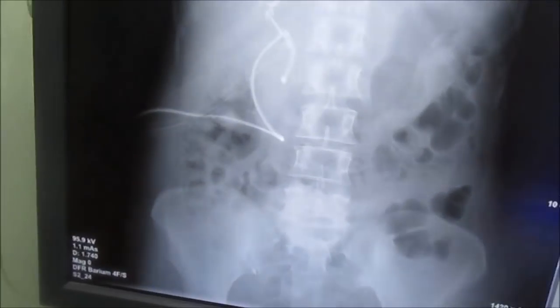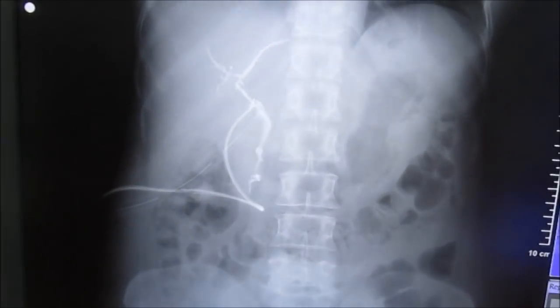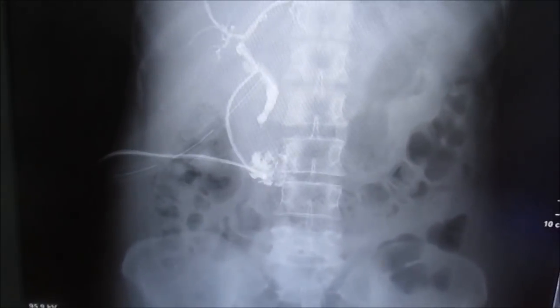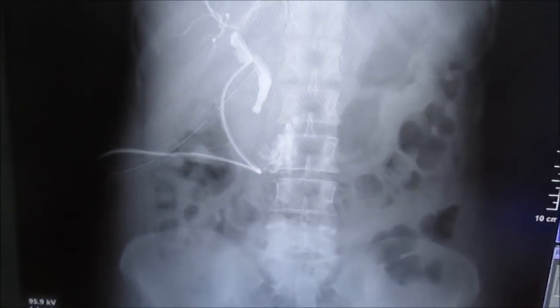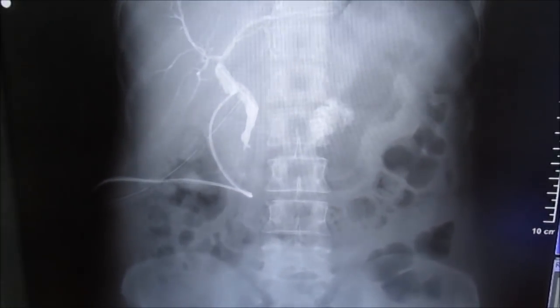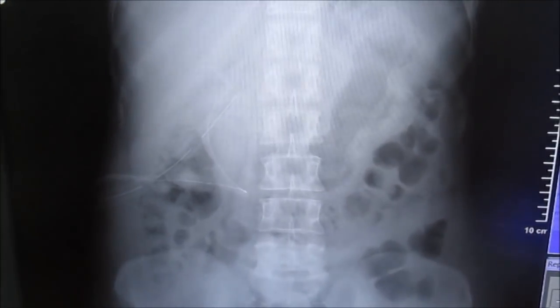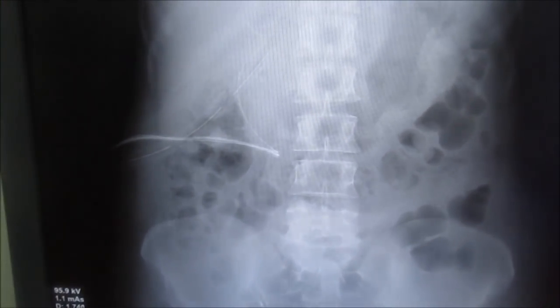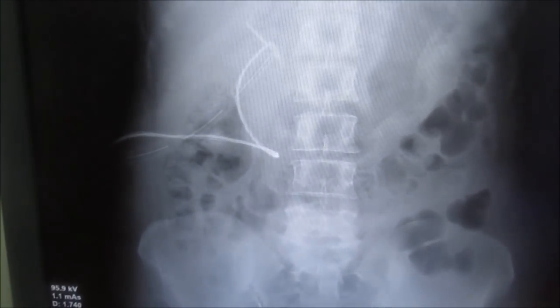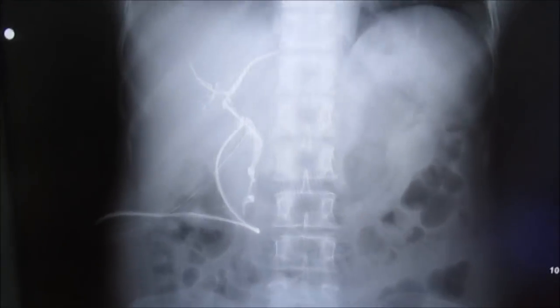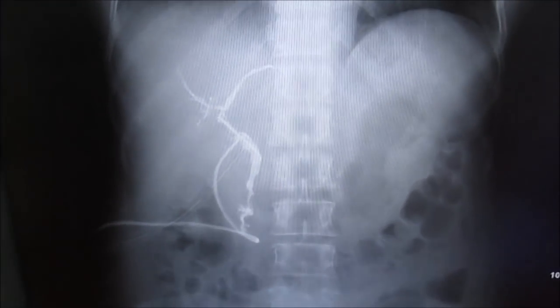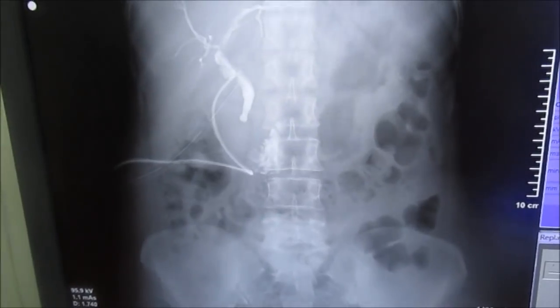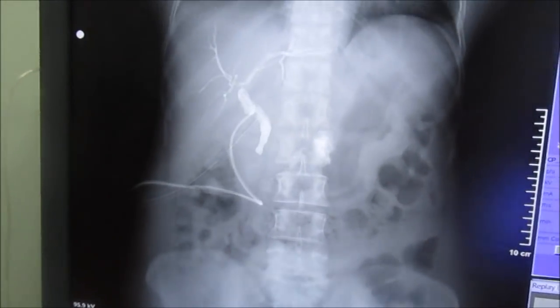We can also see the stump of the cystic duct which was ligated or cut while removing the gallbladder, and there is no evidence of any leakage from that path. Below, we can see the common bile duct as it enters into the duodenum. This is how the T-tube cholangiogram video looks.